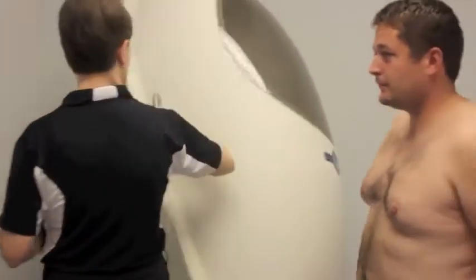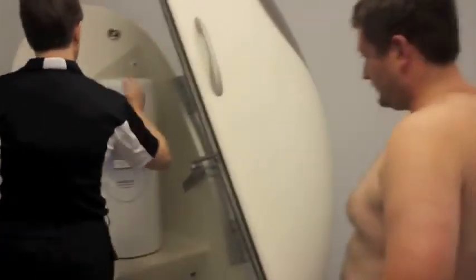It likes it. Okay, so we're going to open the door, get the cylinder out, and you get to take its place in a moment.